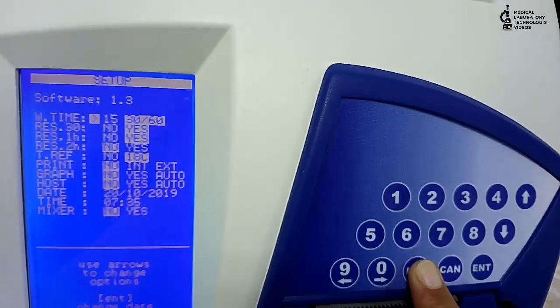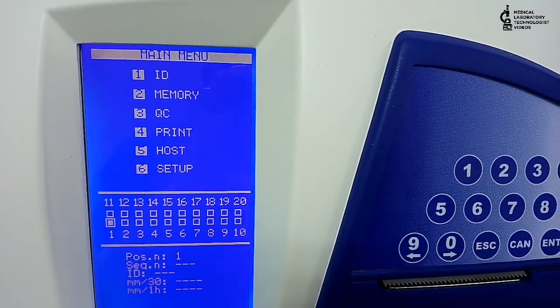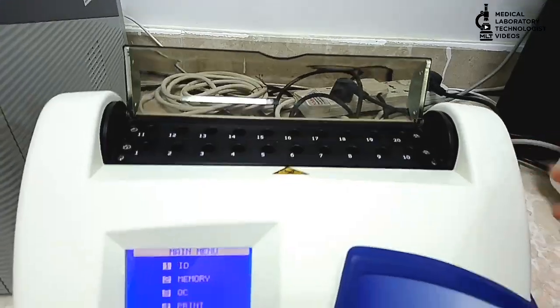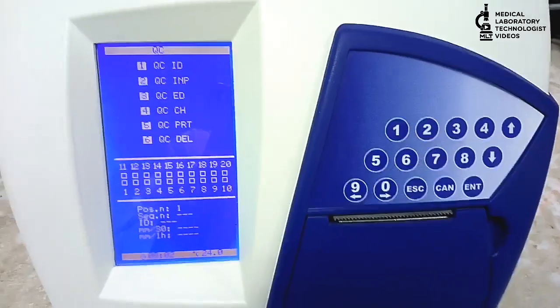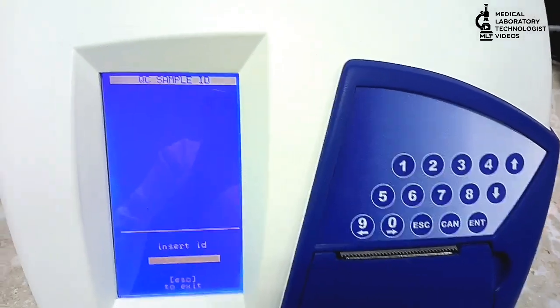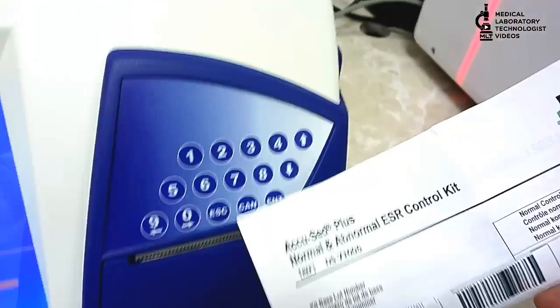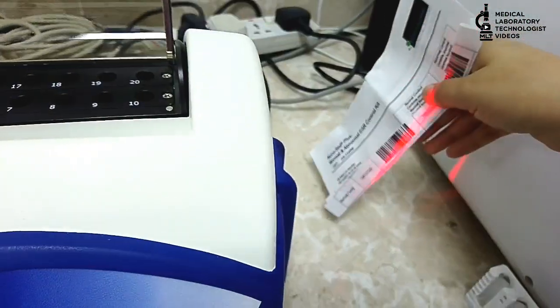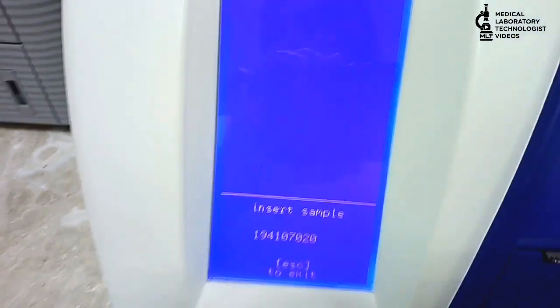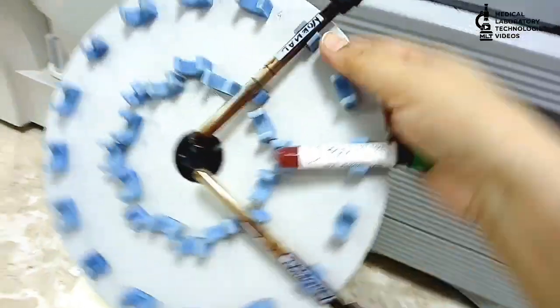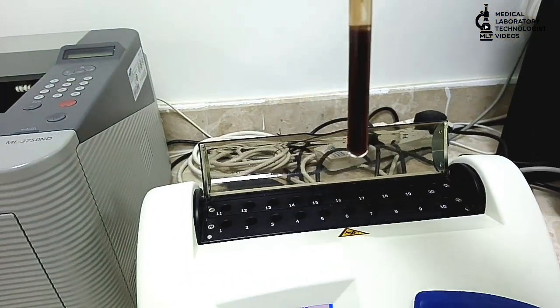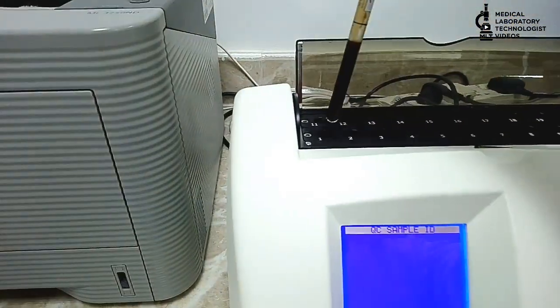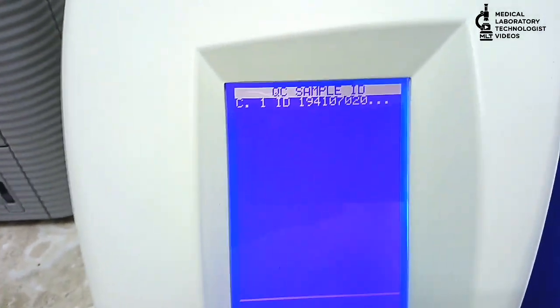Now I will come to main screen. I open the cover and go to option 3 because first I have to run control. I will choose option 1, QC ID, and now you can see barcode. I read the barcode. Now it says insert sample. First I will keep normal sample - you see it is settled full, and you can keep it in any position. The machine will automatically detect.